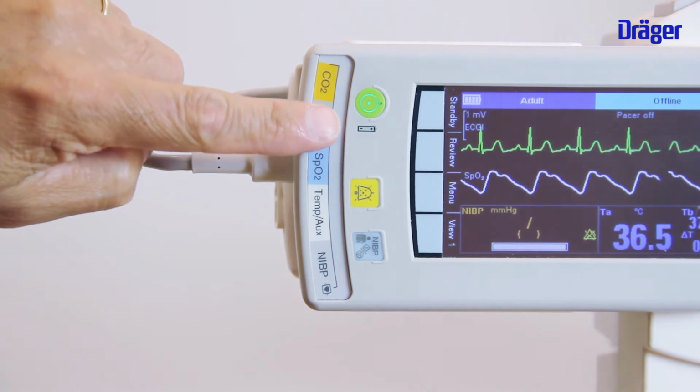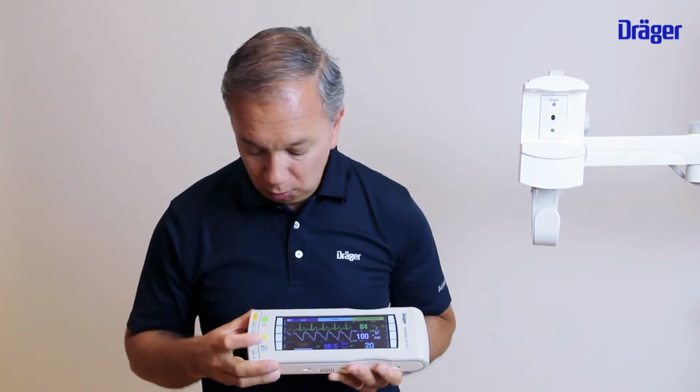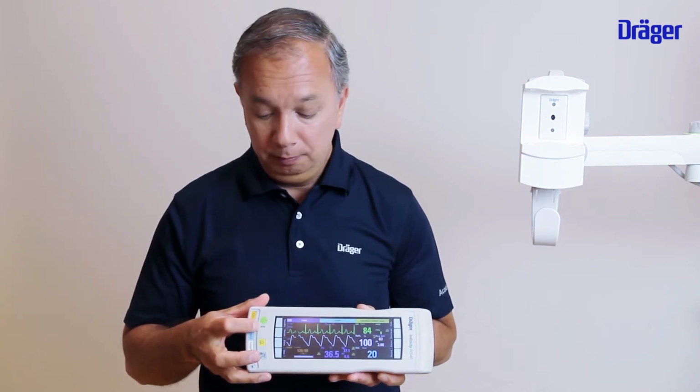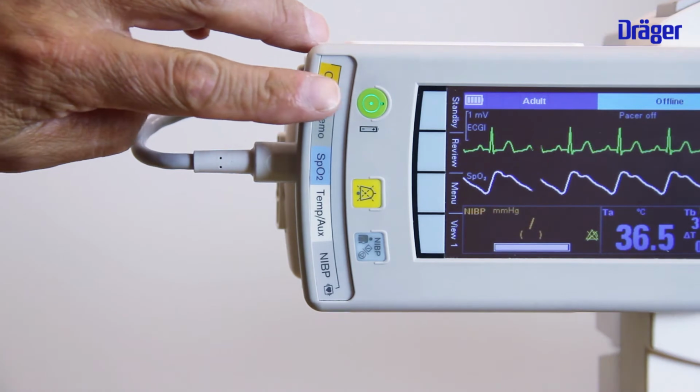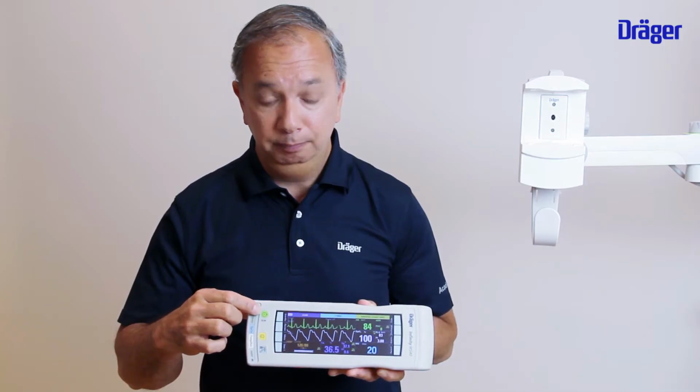Just below the green button there is a symbol, which is the battery symbol. So this one is grayed out now, which means that you are on transport. If you look at the green button, which is flashing now, a flashing green button means that you are on battery.